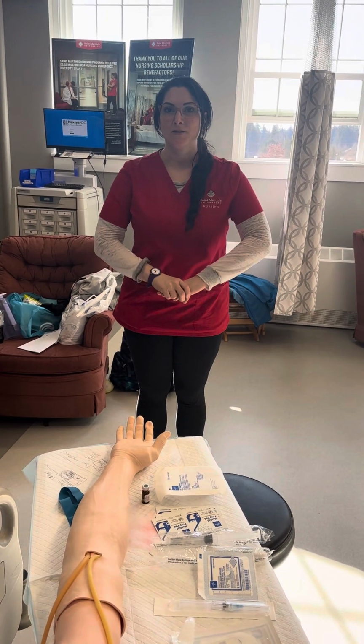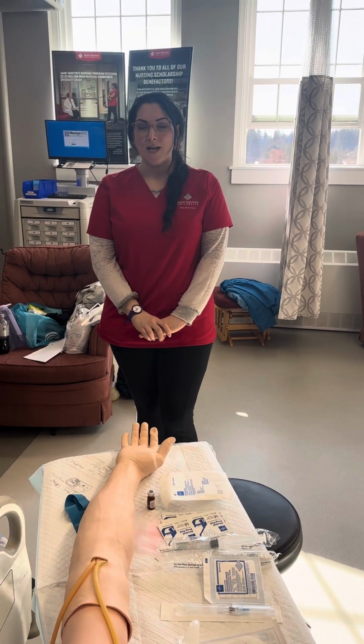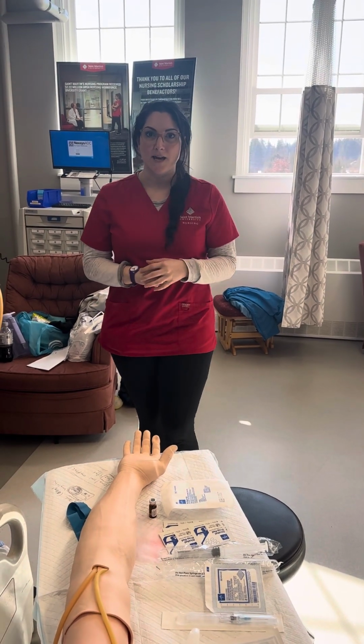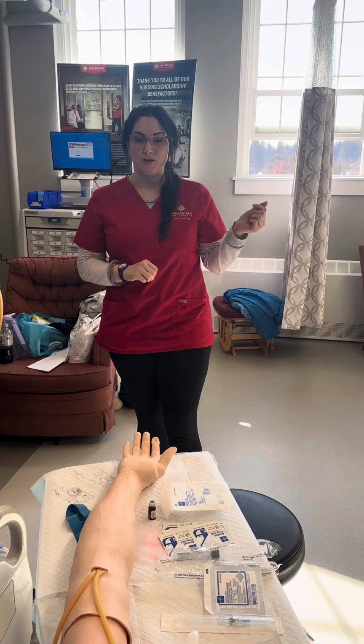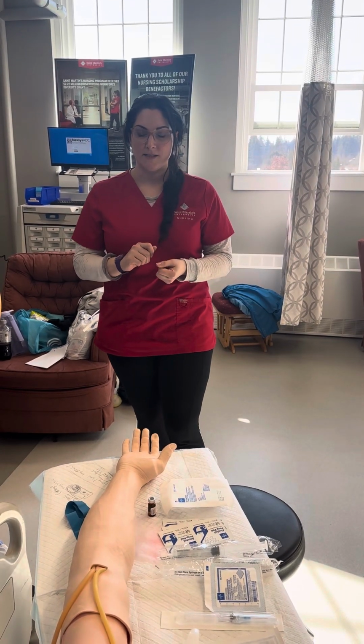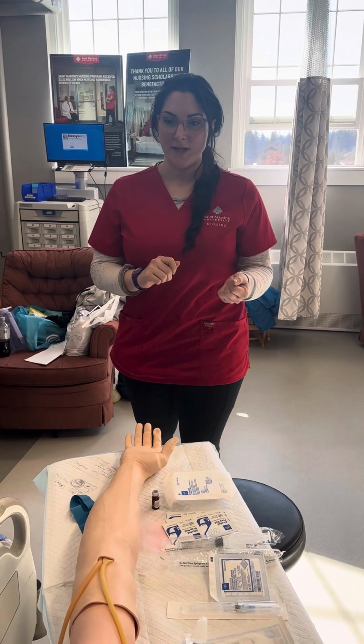Hi, I'm Sarah. I'm a student nurse at St. Martin's University. I have my patient Scott Mingus here, and he needs to get an IV catheter inserted. I have pulled up the MAR, and he has an order put in for morphine.